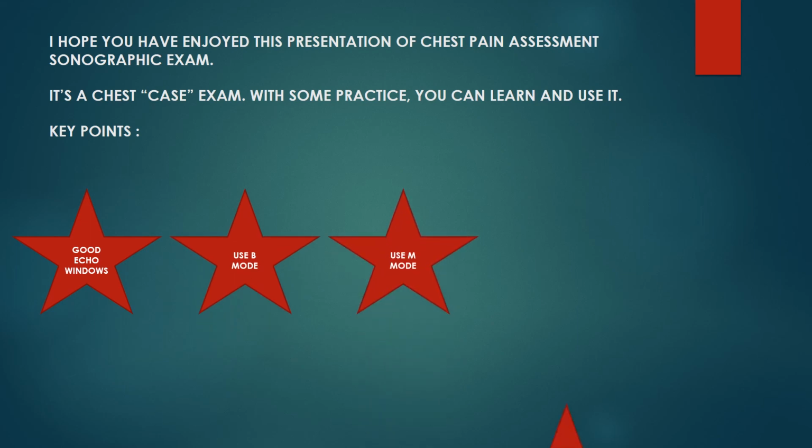It's important to practice if you want to have this exam. Use good echo windows, use B mode, use M mode, follow a checklist, and use the correct probe to examine the patient.